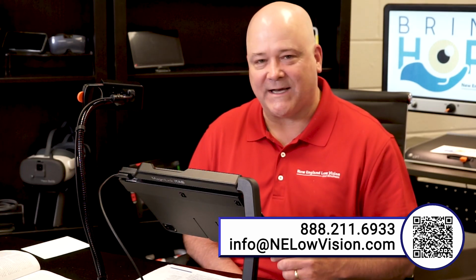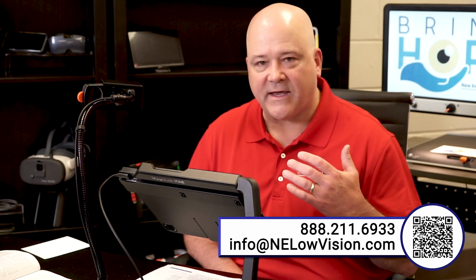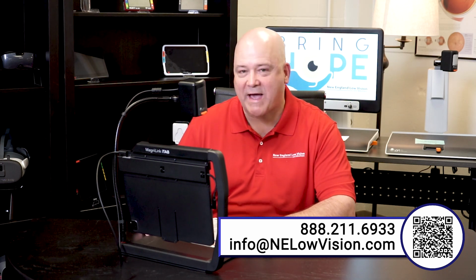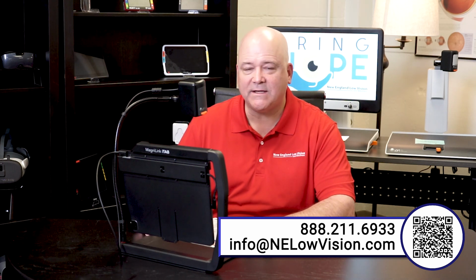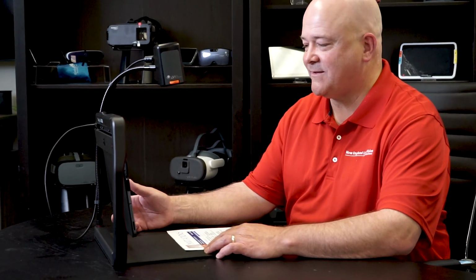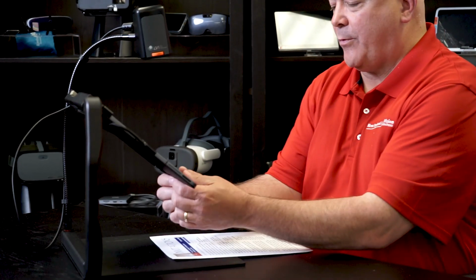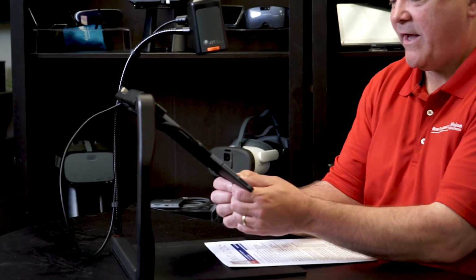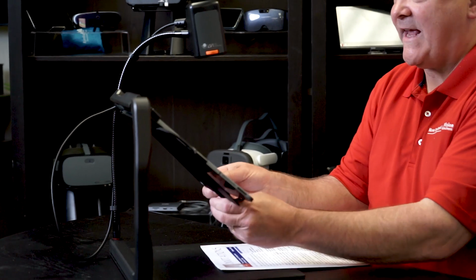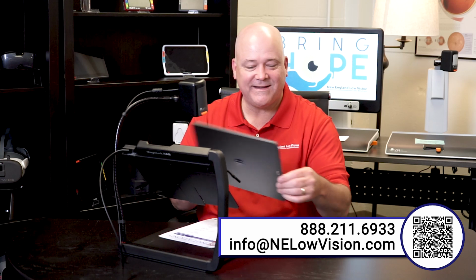And one of the last things that we'll show you is how slim this is and how easy it is to transport from place to place. Okay, so when you're finished to pack this up and to disassemble it, it's pretty easy. So number one, we'll turn off the iPad. Then we're going to remove the iPad by using both thumbs. We're going to be pressing down on the orange and then pushing up from the back. And then the iPad will separate from the stand. Remember to unhook the USB-C cord, and there's your iPad.